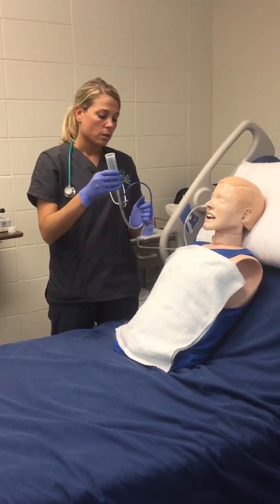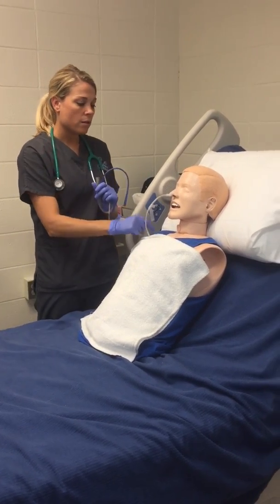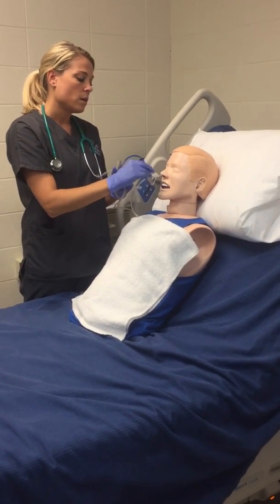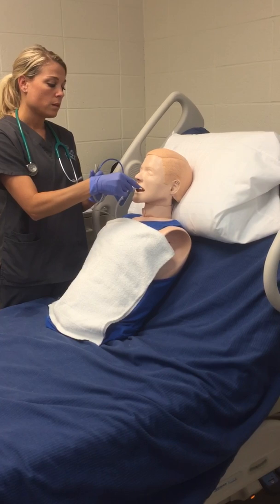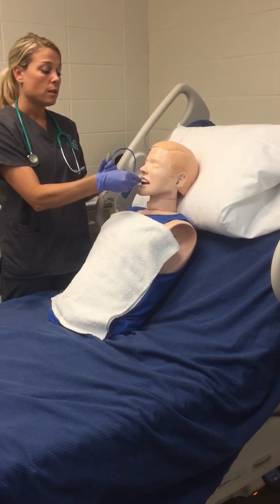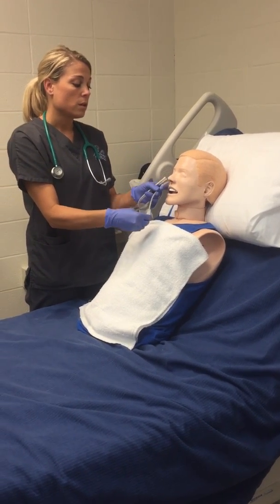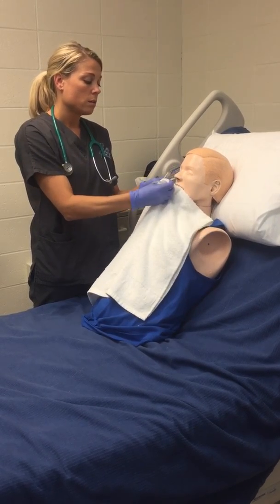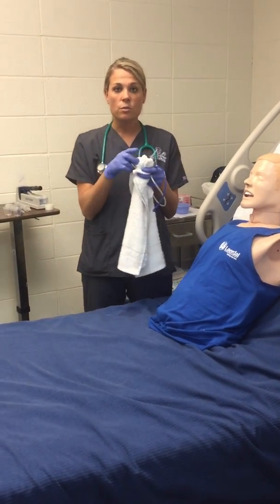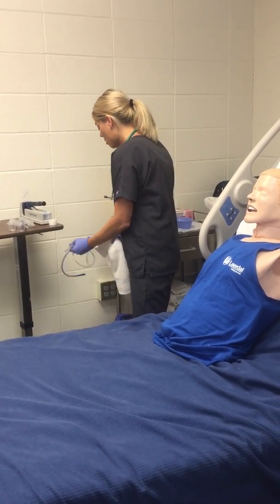Once that's gone through, I'm going to remove that syringe. I'm going to take the safety pin off the gown, and take the tape off the patient's nose so we can remove it. I'm going to pinch the tubing and have the patient take a deep breath, and then slowly, gradually, gently pull out the tube. Okay, and then we're going to check the intactness of the tube, make sure everything's intact, nothing was left behind, and then we will dispose of all of that.